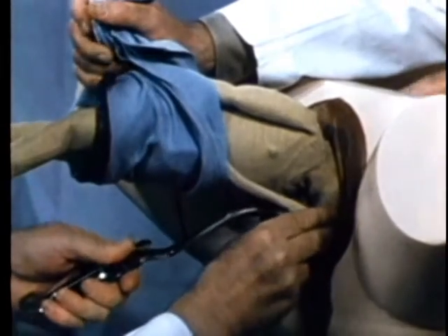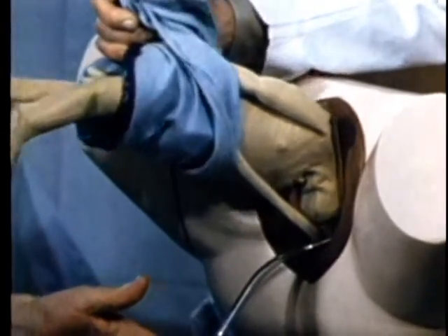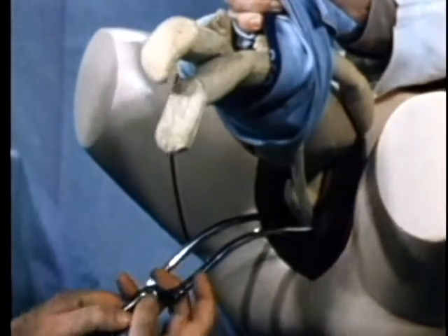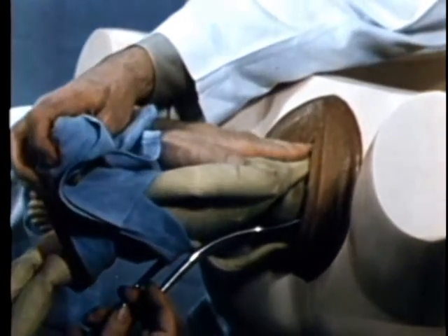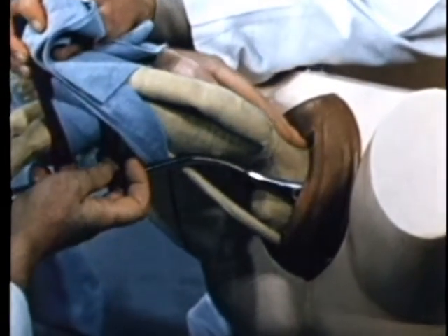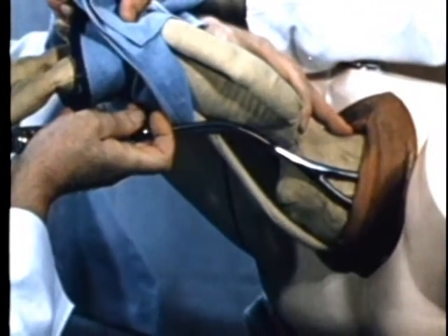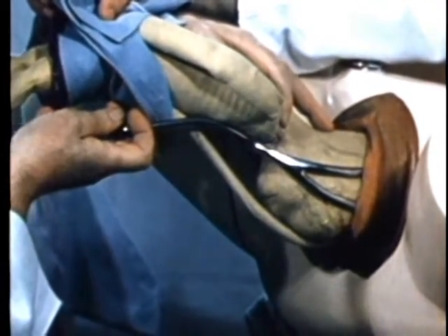Left blade to the left side, to the right ear. The body is carried to the opposite side. Right blade, right hand, right side, left ear. Then the body is lowered to the level of the shanks. The left hand of the operator splints the neck. Pump handle maneuver, gradually making progress until, with good flexion at the outlet, the head comes out with the handles at the level of the horizontal.